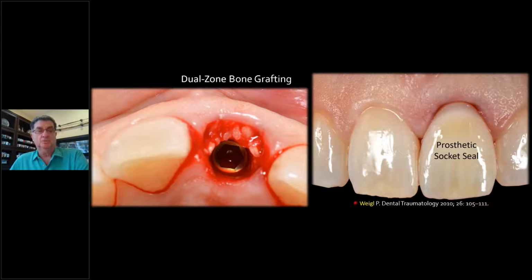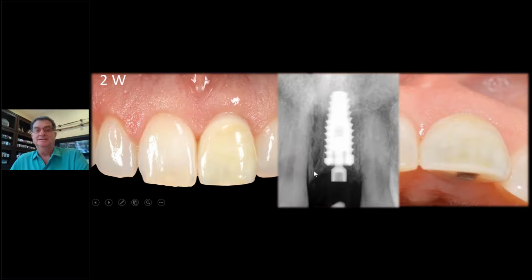And this is what it looks like in 2 weeks. There's the implant. Notice it is below the interdental bone, exactly what I was talking about. See, here's the interdental bone. Look at the scallop. Normal. That's what we expect. So it's about 3 millimeters below the interdental bone, but it's at about the buccal plate, maybe a millimeter apical. There's a beautiful implant, beautiful platform shift. And look at this at 2 weeks.